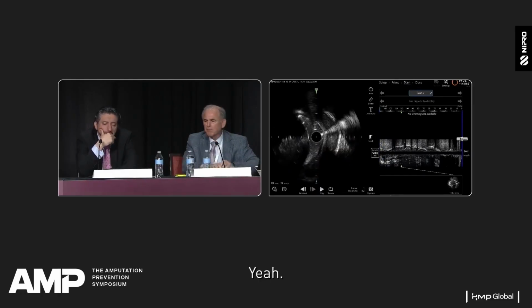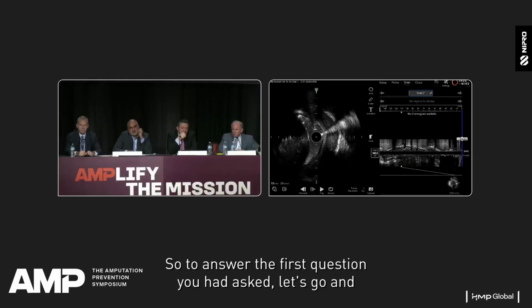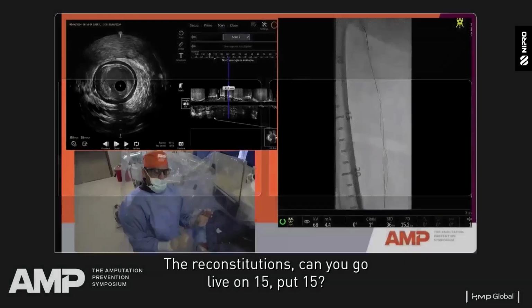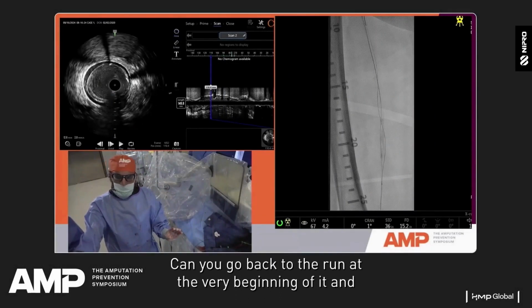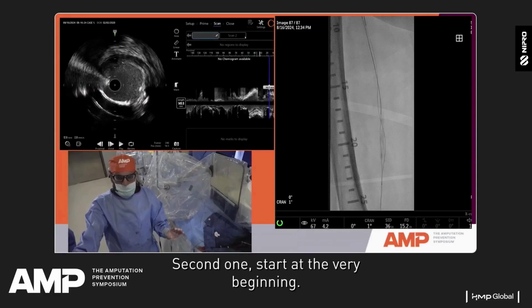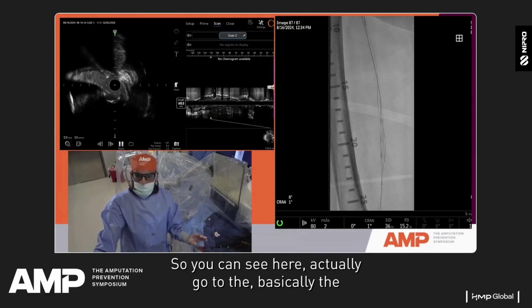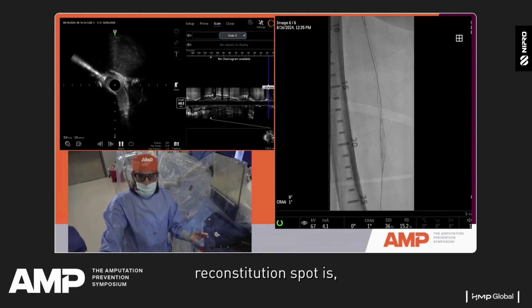Yeah. So great question. So to answer the first question you had asked, let's go and retrieve it. The reconstitution zone, can you go live on 15, put 15? IVUS told us. So I don't know if you could see it. Can you go back to the run at the very beginning of it and just, second one, start at the very beginning.